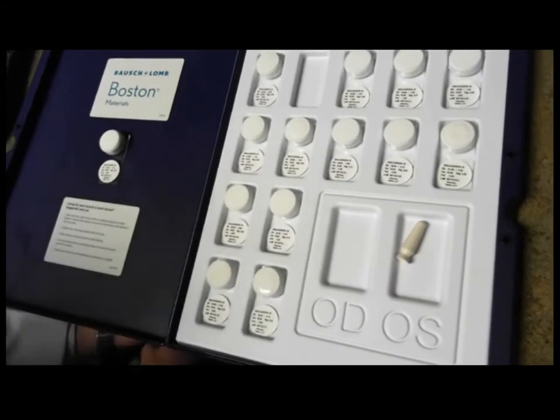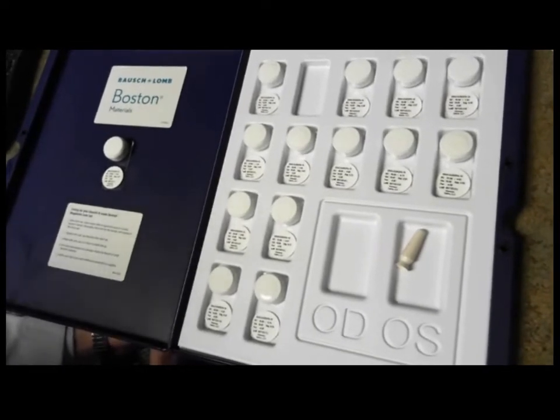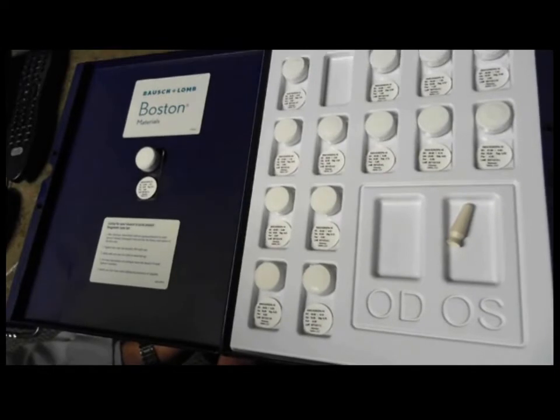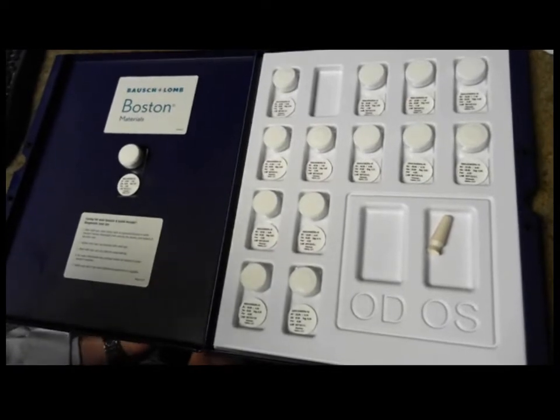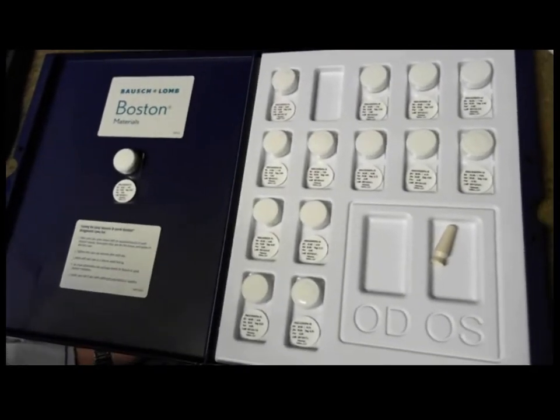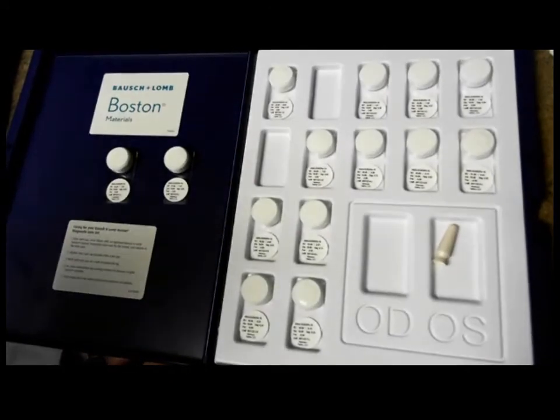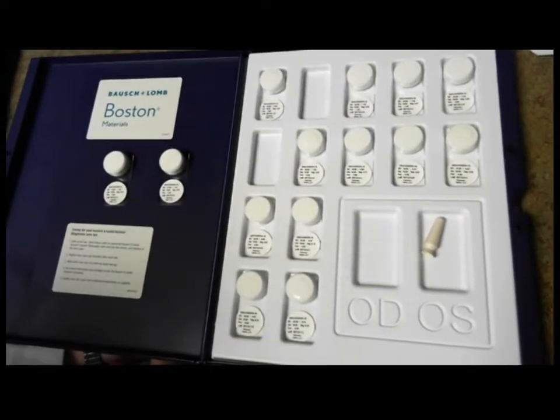And then for fun, on the left eye, we're going to fit the lens two diopters steeper. The typical idea with a patient with keratoconus or some other corneal irregularity is to fit two diopters steeper than steep K. And that should give you the ability to vault any abnormality. But in our case, because of the Salzmann's, we want to fit more oblately. And so we're going to pick something that's on K for the right eye. But just for fun, we're going to go two diopters steeper on the left eye. Since our steep K was around 45, we're going to pick a lens that is 47 diopters in curvature.